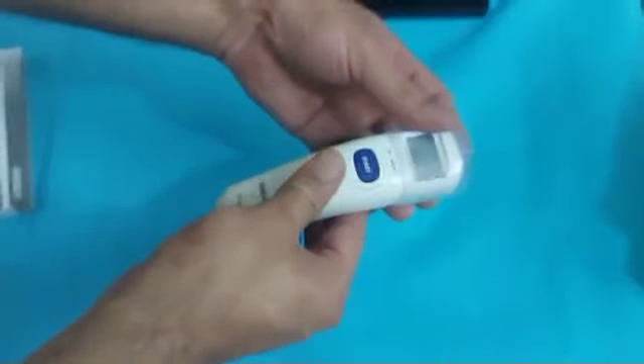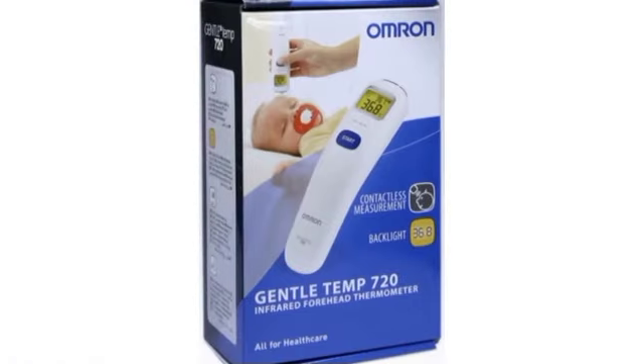Always keep the protective cap on the scanner to protect from damage and dust. That was all about how to use the Omron Gentle Thermometer.